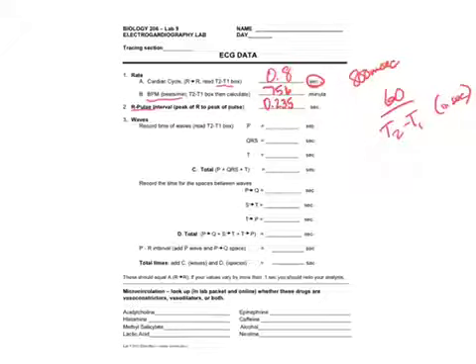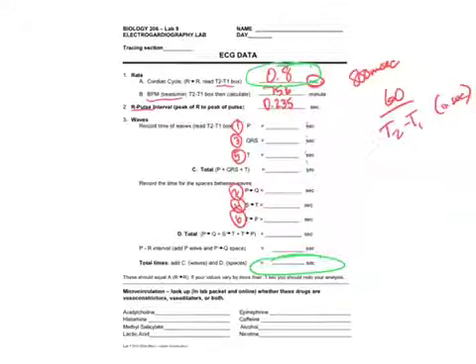I normally show this in class, is do the P wave first, then P to Q, QRS, S to T, T, and then T to P. You're going to flip-flop between these, and let me show you why. This number here should equal this number here. So this is the whole, and then these are the individual parts that we will be adding up. And they need to be within 0.1 seconds.